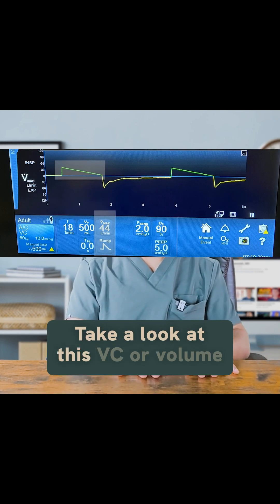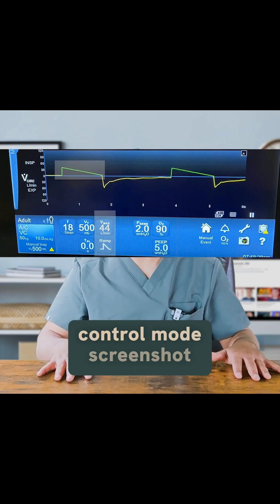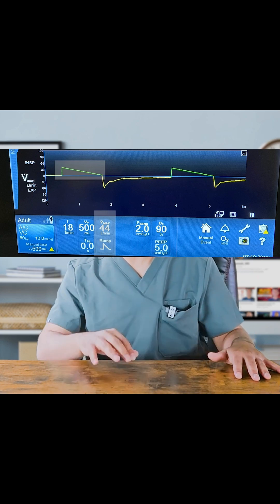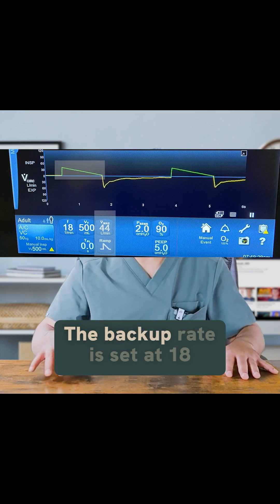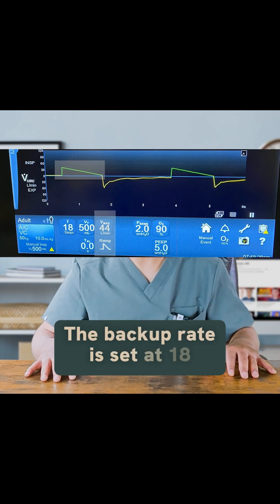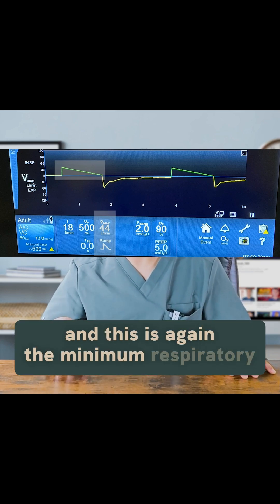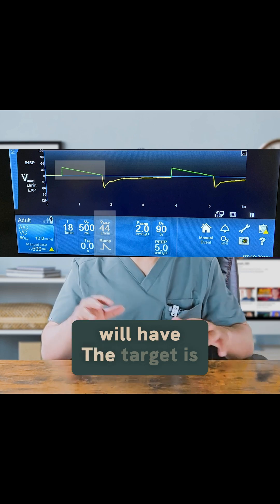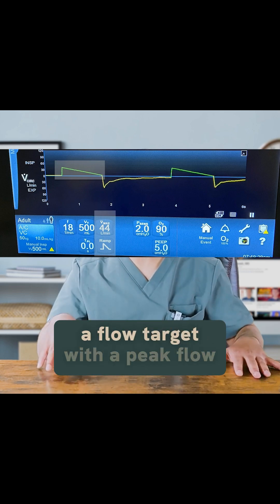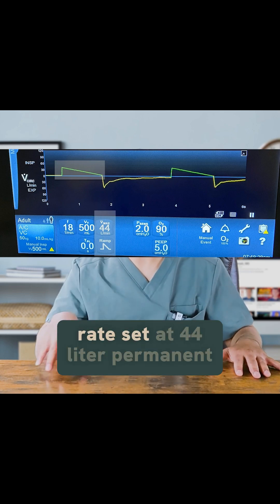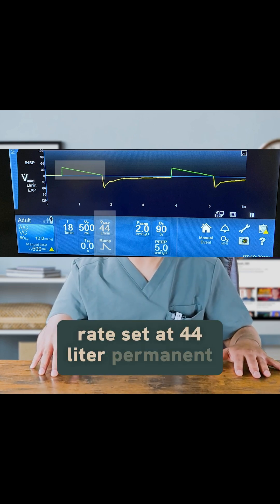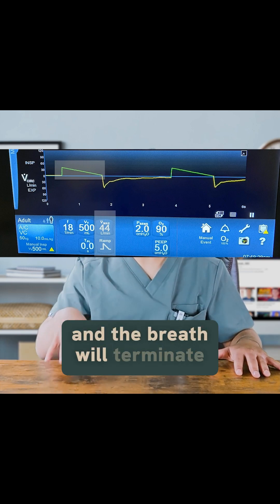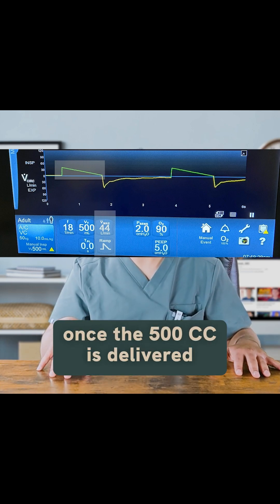A reasonable starting peak flow rate is between 40 to 60 liters per minute. Looking at this VC mode screenshot, the trigger is AC, and that specific breath was a control breath. The backup rate is set at 18 — the minimum respiratory rate the patient will have. The target is a flow target with a peak flow rate set at 44 liters per minute with a decelerating ramp curve, and the breath will terminate once 500cc is delivered.